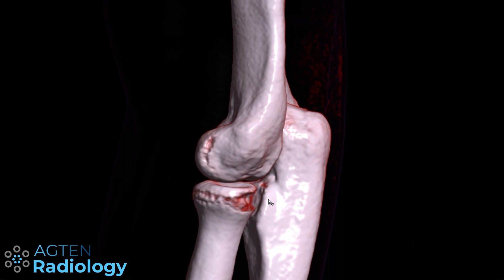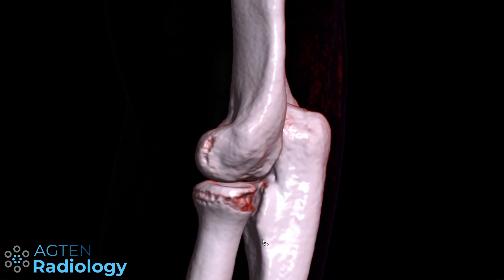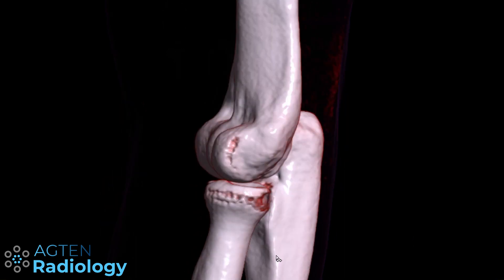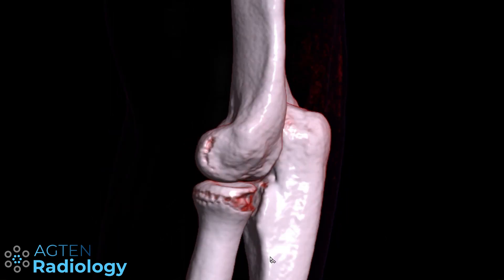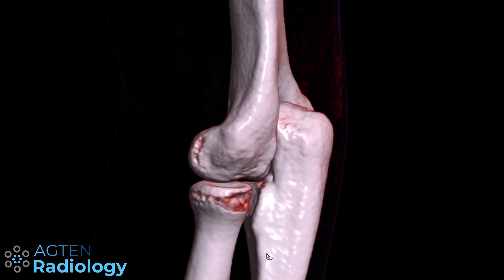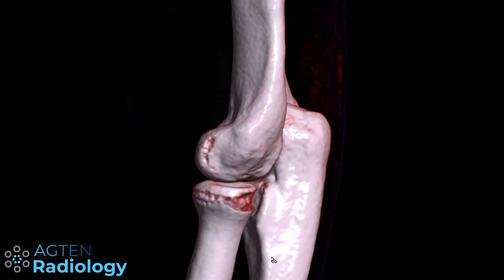So this is the radial notch, and from the radial notch we have this crest here. This crest is called the supinator crest, and sometimes you have a little tubercle at this region, which is also where the lateral ulnar collateral ligament inserts. So the lateral ulnar collateral ligament is inserting here onto this supinator crest.